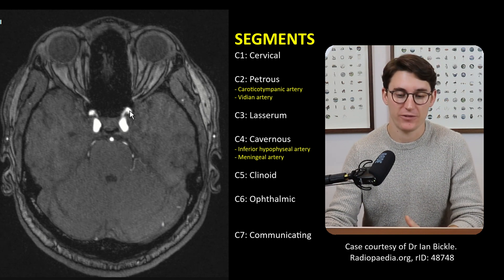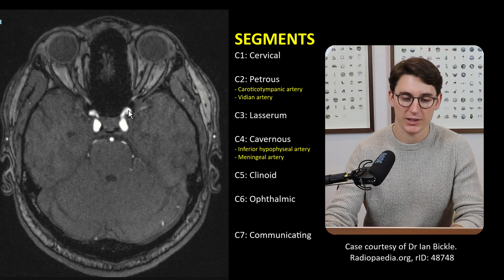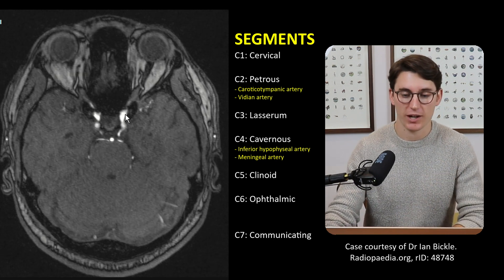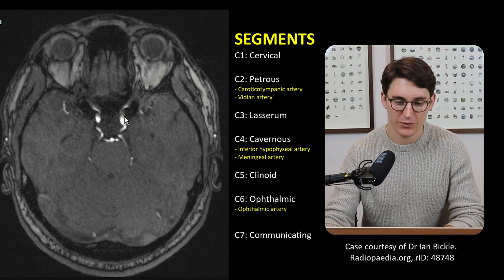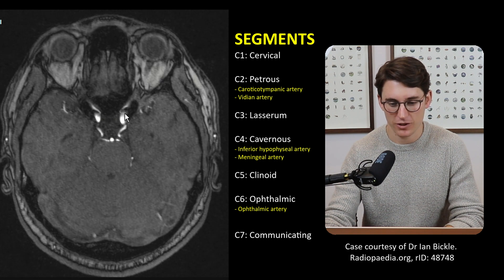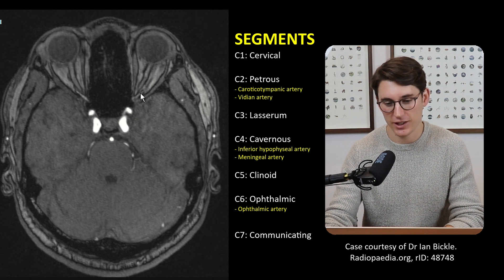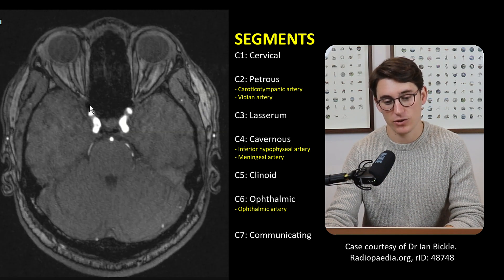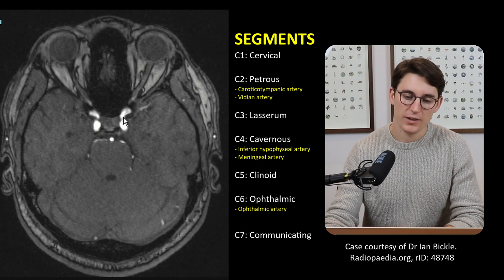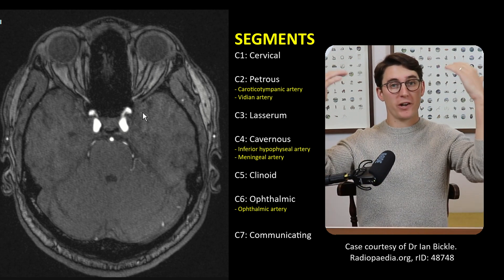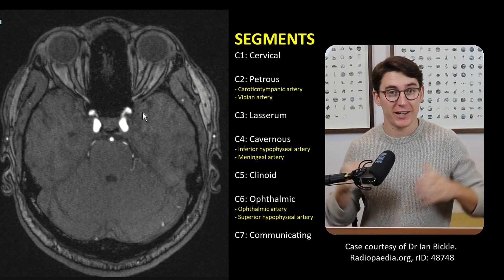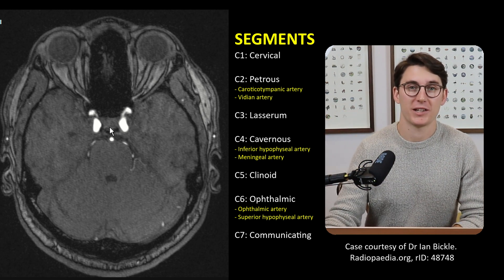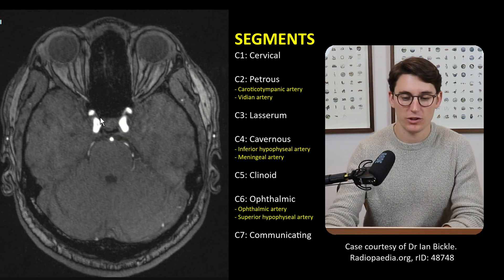Then again we loop our clinoid segment, C5 — there are no branches of the clinoid. And we come around into our ophthalmic segment, C6, which also has two branches. The first is the biggest branch off the ICA — the ophthalmic artery. On the patient's left-hand side we can see the ophthalmic artery coming off, and we can follow it through the optic canal heading into the orbit. The same on the other side — you can see that ophthalmic artery coming off the right, heading through the optic canal into the right orbit. The second branch off C6 — since we are now superior to the pituitary gland — is the superior hypophyseal artery, which supplies the anterior portion of our pituitary gland.